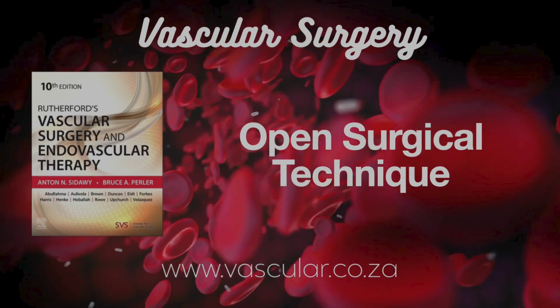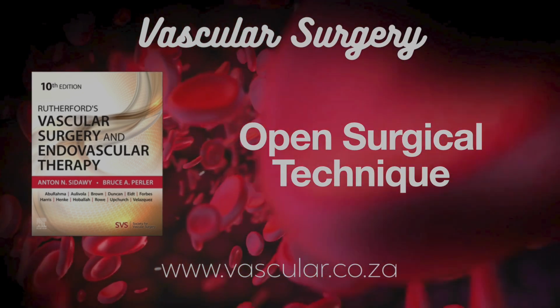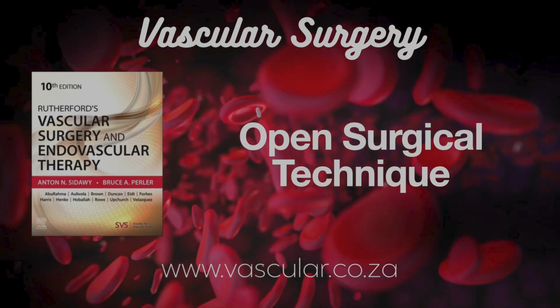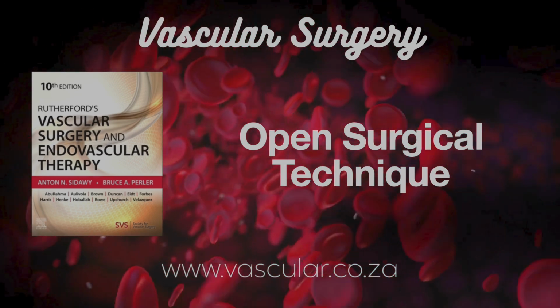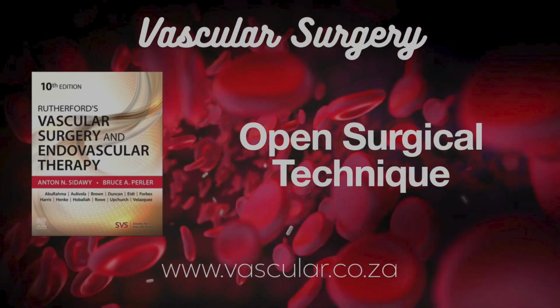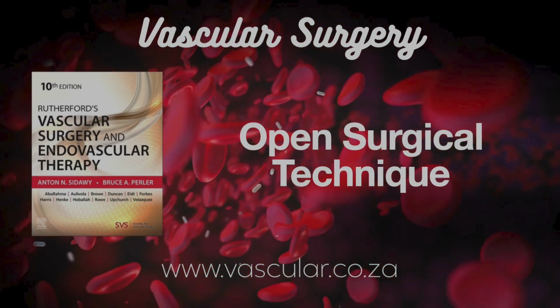Whether it formed there or traveled from elsewhere. Exactly. A thrombus forms locally, an embolus travels. Often, thrombus forms around an embolus due to stagnant flow, hence thromboembolectomy. What does it achieve? Restores blood flow quickly and lets you examine the clot to see what it is. Key things to get right. Choosing the right spot and shape for the arteriotomy, the incision into the artery, selecting the right catheter, minimizing blood loss and injury, steering the catheter correctly, and making sure you get all the clot out.